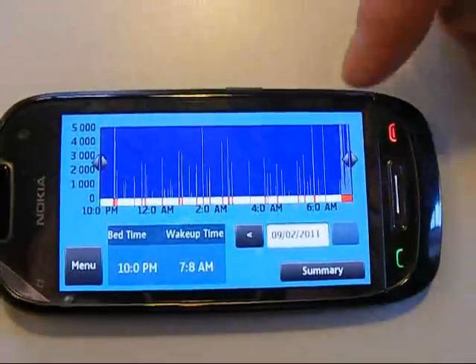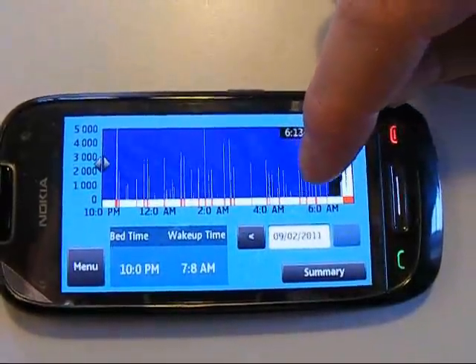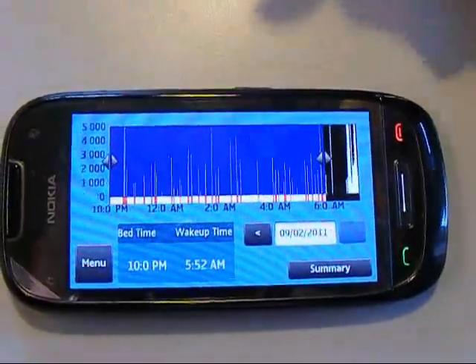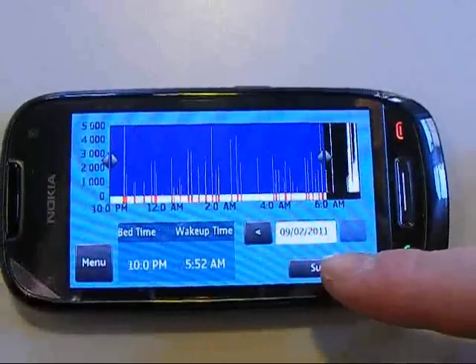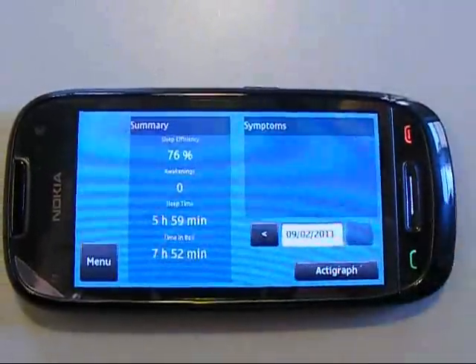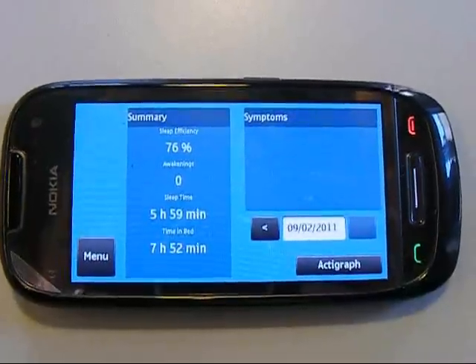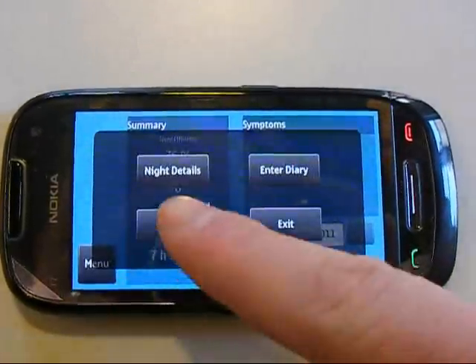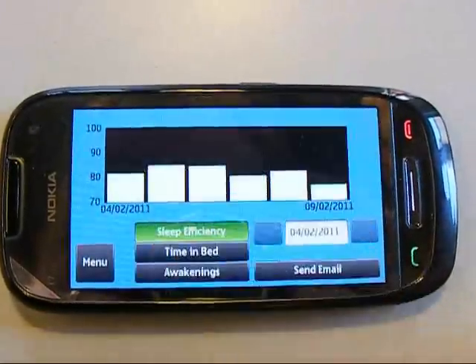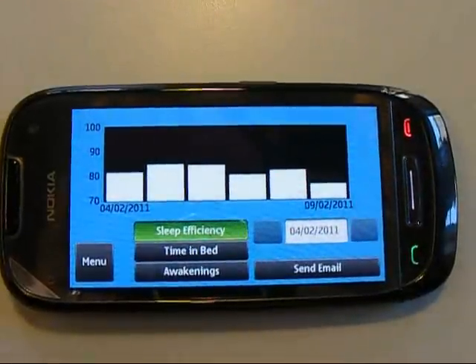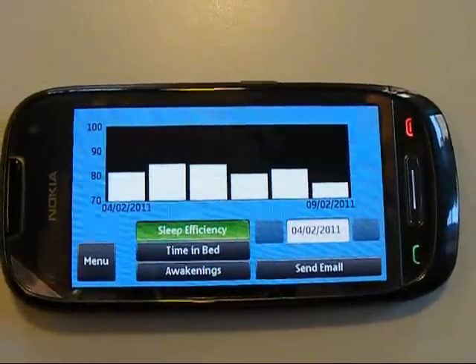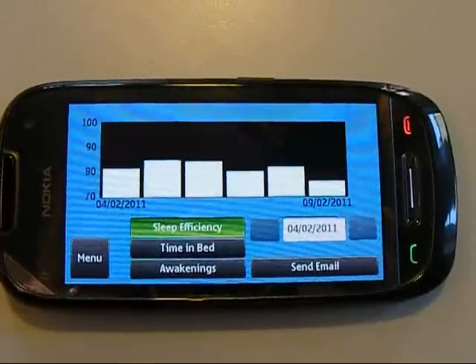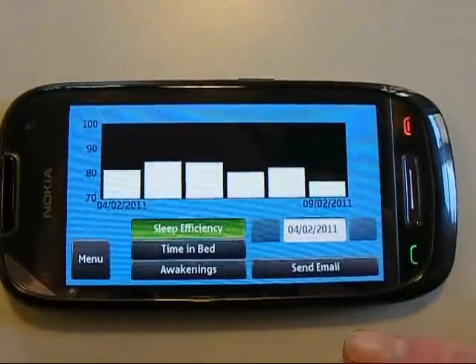You can also adjust the times you woke up in the morning, for example. If you press summary, it will show your sleep efficiency, and there is also a history where you can see your sleep efficiency over the last few days or more.